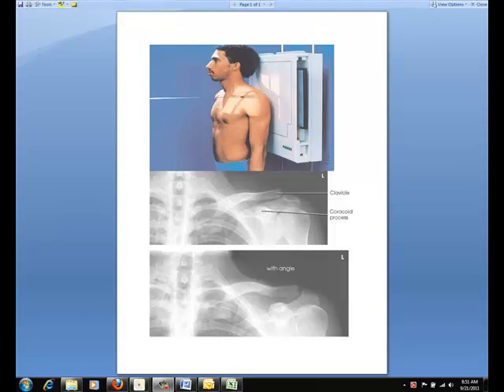When confronted with an injury to the clavicle, typically two projections are performed. The first projection is the AP projection. For this, place the patient in the supine or upright position. If the clavicle is being examined for a fracture or destructive disease, or the patient cannot be placed in the upright position, you may use the supine position to reduce the possibility of fragment displacement or causing additional injury.